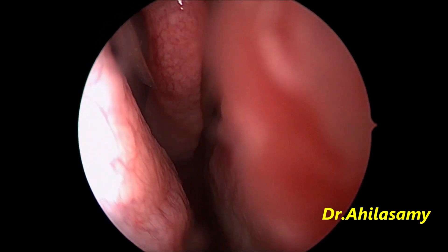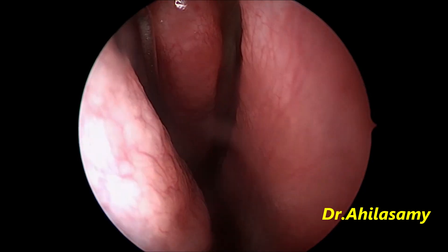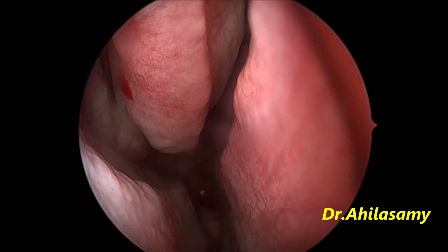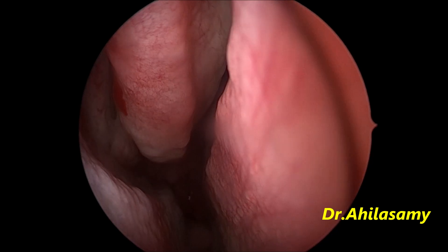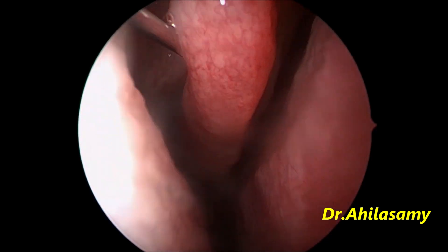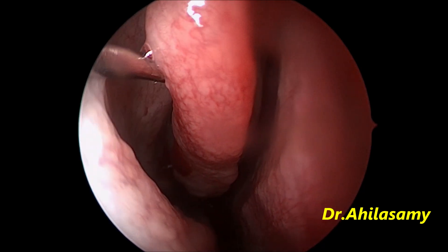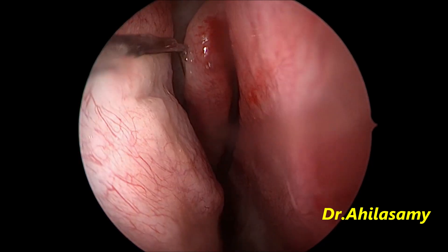Now I have come to the right side. I can see the sphenopalatine area after several decongestant applications — I could get some space. I am still able to visualize, but with difficulty I am giving the block. I am not sure because of the septal deviation; I couldn't land the needle properly. The needle is slipping because of the septal deviation, so I am giving that block blindly.